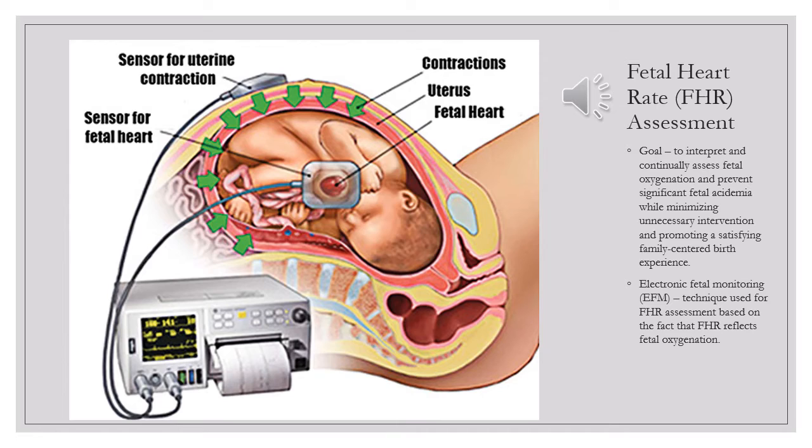The goal of fetal monitoring is basically to make sure that the fetus is okay and is able to tolerate contractions during labor. The fetal heart rate is a reflection of the fetus's oxygenation status. So that's why we're looking at it, and we'll be watching for the different patterns.